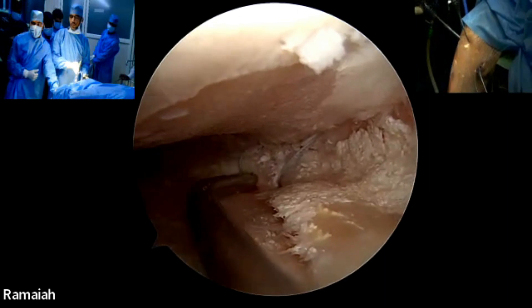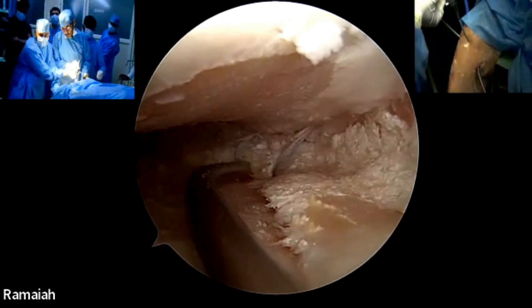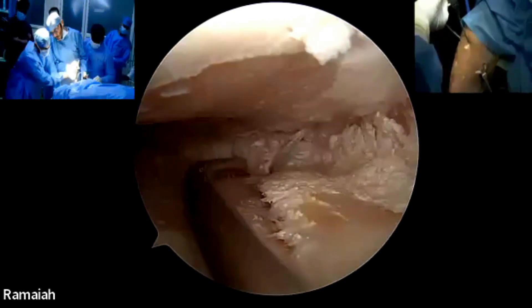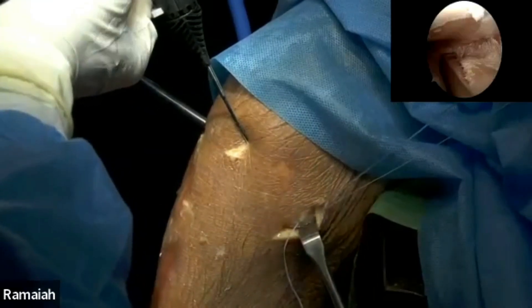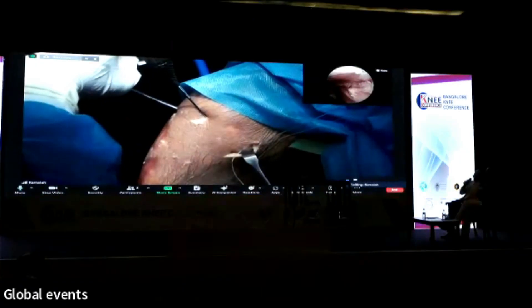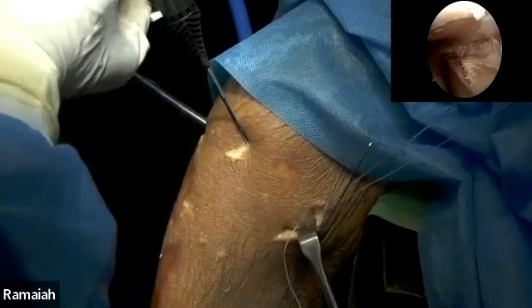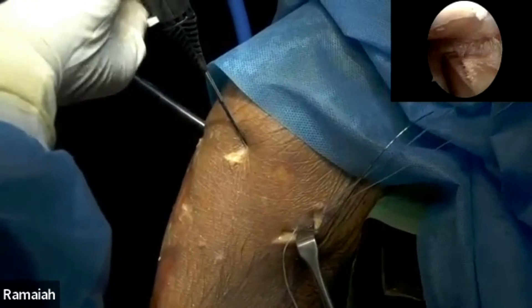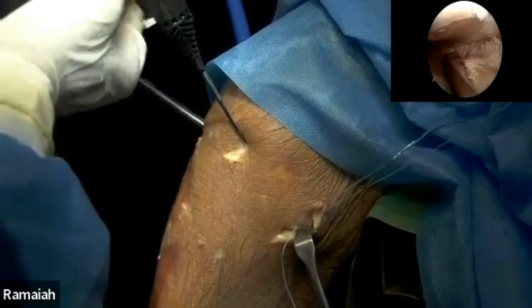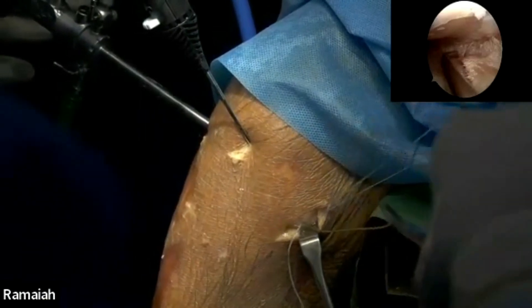Now we are going to put one underneath the meniscus like this. Pass the needle again — keep watching the skin. Inside-out is actually a fairly simple technique which is also cost effective. On the lateral side, you have to be careful about the peroneal nerve, so you have to make sure your incision is in the right place. Keep pulling the needle — pull it, pull it.